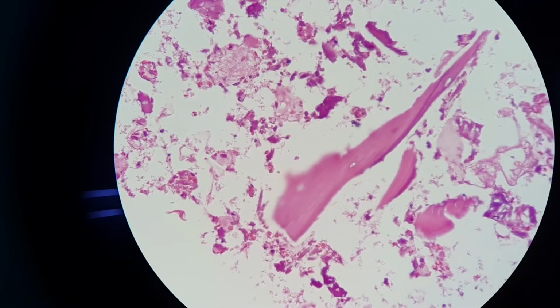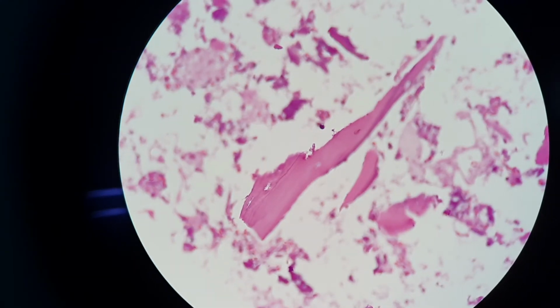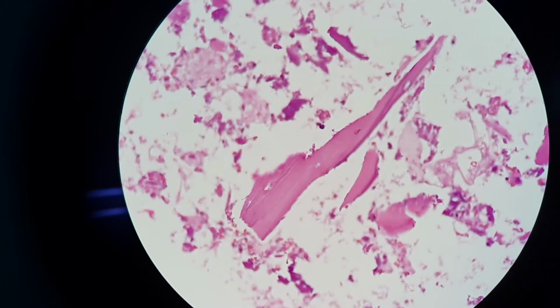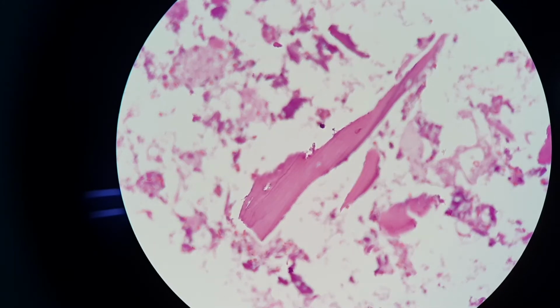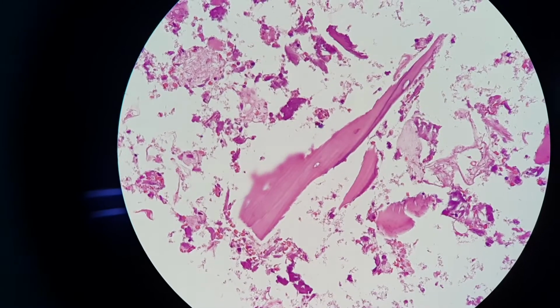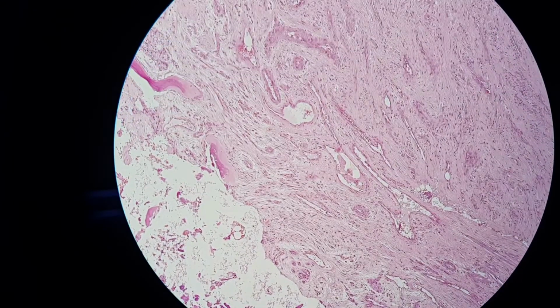And adjacent here is one fragment which is still viable, but in a fragmented manner. Most probably there have been some recent fractures in this patient due to something. Okay, that's interesting. So we have a look at a few other areas, and you can see there's a lot of fibrosis here.